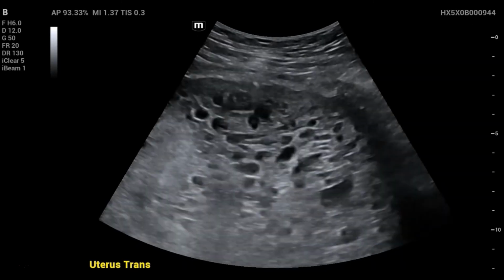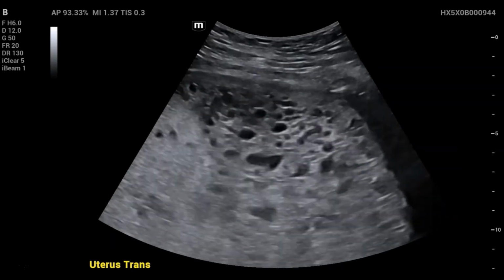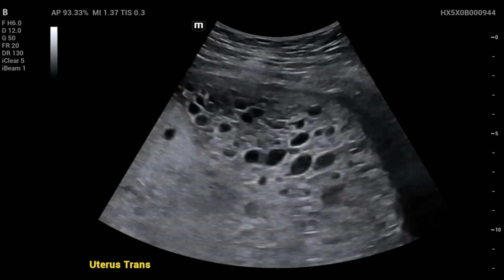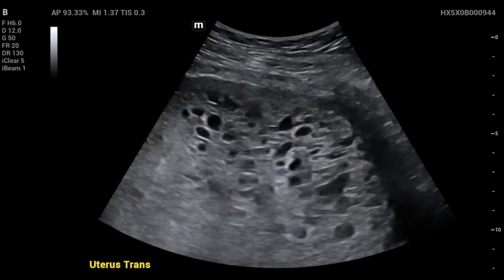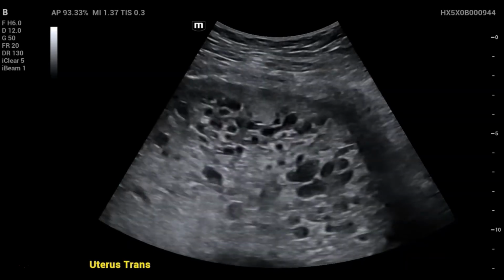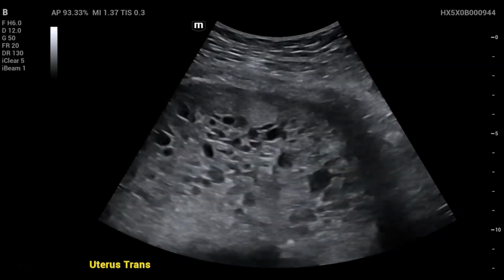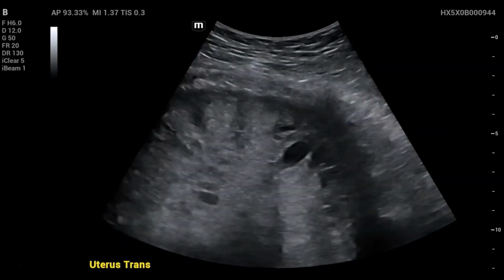Now, I recognize that a lot of this feels sort of scary and uncomfortable given the fact that this is a very broad introduction to a very detailed topic. But as a reminder, for any point-of-care ultrasound, all you need to do is do a view of the structures you're interested in in long and short axis, and that's a great start. So in this situation, you do a sweep in short axis of the uterus, a sweep in long axis of the uterus and bladder, and show me both in both axes. Then you'd move over and try to see if you could see the adnexa at all. If you can see the ovaries, that's great. If you can't, that's okay as well, as long as you've at least looked in that area to ensure that there isn't any evidence of a large mass or intraperitoneal hemorrhage or anything of that sort.